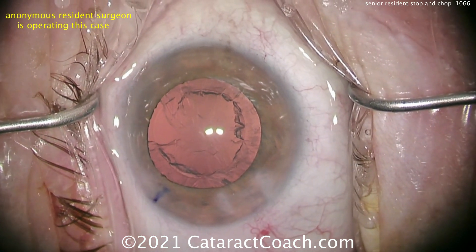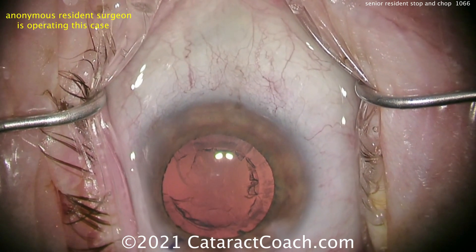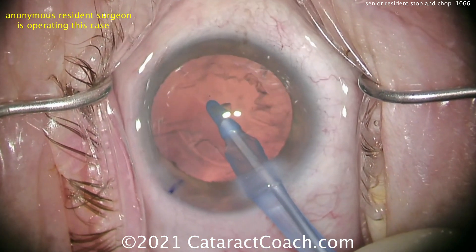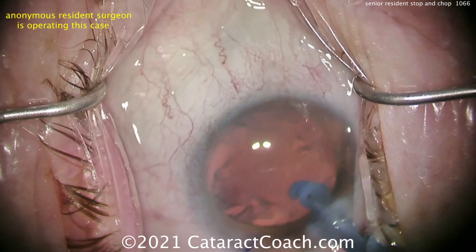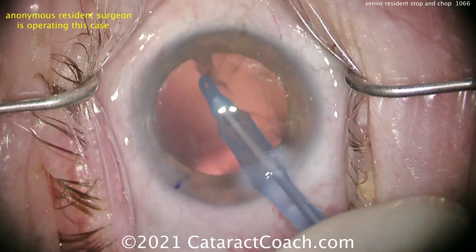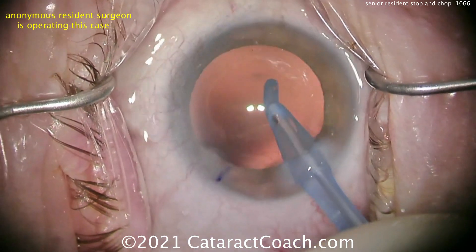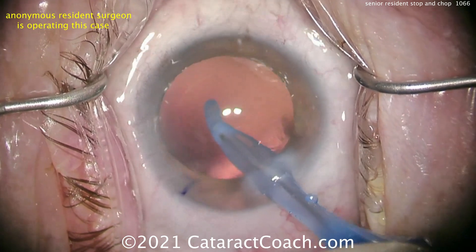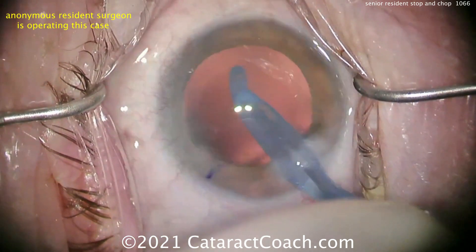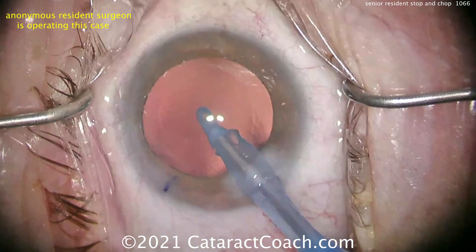We're showing the video in real time from this anonymous resident. I thought about speeding it up to twice normal speed — it's about a nine-minute video. The video was sent to me with the title '9-Minute Phaco.' I get it — it's a cherry-picked case, and the resident wants to pick the fastest case. But let me encourage you: the patient doesn't care if it was a nine-minute case or a twelve-minute case. The patient cares about how perfect the case was.